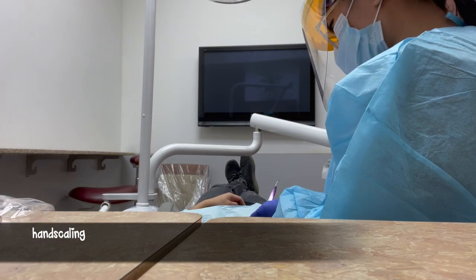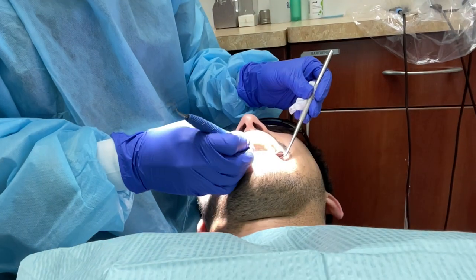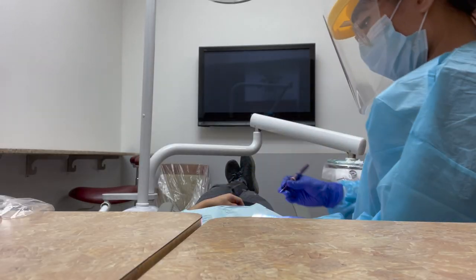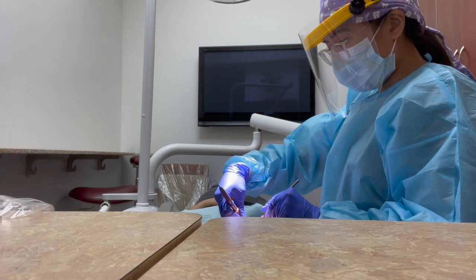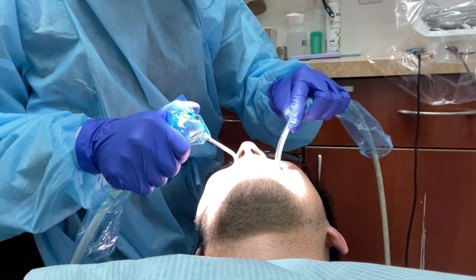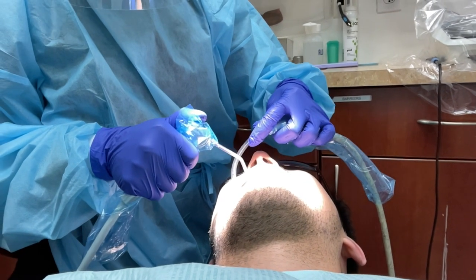Here is part of what the cleaning looks like. After I use the cavitron, I go in and hand scale to fine-tune everything to make sure all of the plaque and tartar is removed. Sometimes I can't get all of the tartar off with the cavitron, so I go in with the hand scalers to remove everything else. Now I'm giving my patient a rinse with water to get rid of all the debris. I forgot to record the rest, but I also polished and flossed his teeth.